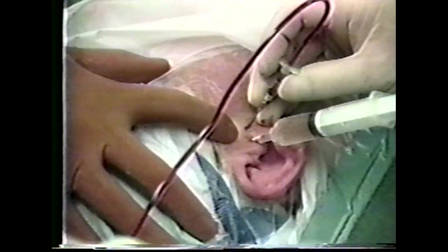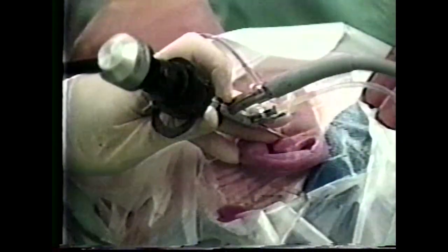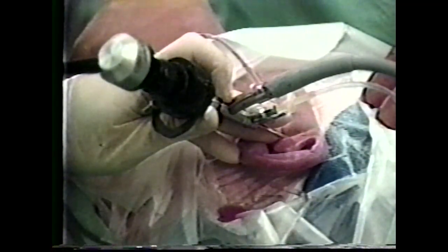As the oral and maxillofacial surgeon's skill in temporomandibular joint arthroscopy becomes greater, certain limitations will be found to the traditional infralateral and anterior lateral approaches to the TM joint. This is especially true if visualization of the lateral trough and anterior lateral joint space or instrumentation access for the medial and lateral trough is required. Clear visualization of these areas is difficult with the current 15-degree angled scopes and lateral portals.